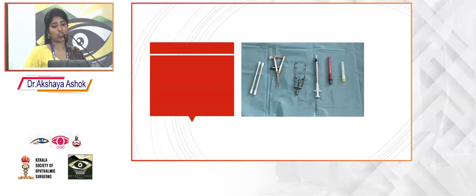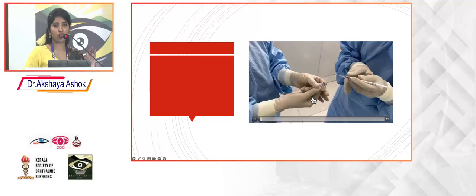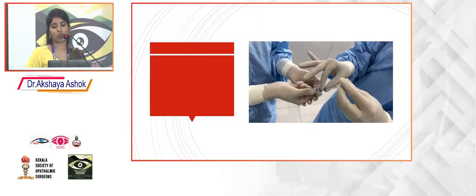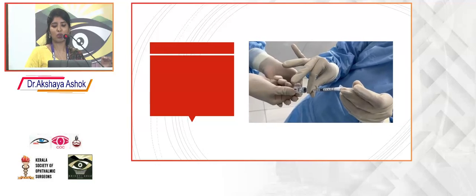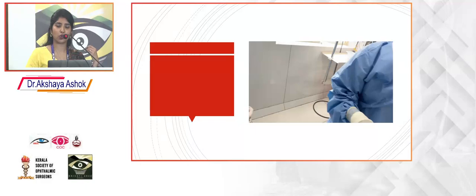To give an injection, all we need is a pair of cotton buds, a caliper, a speculum, an insulin syringe, a 30 gauge needle, and a longer needle to withdraw the drug into the syringe. While you withdraw also, we should make sure that everything is done under aseptic precautions. You have to draw 0.05 cc; you can draw a little extra, because some amount of drug can go into the subconjunctival space as you withdraw the needle.